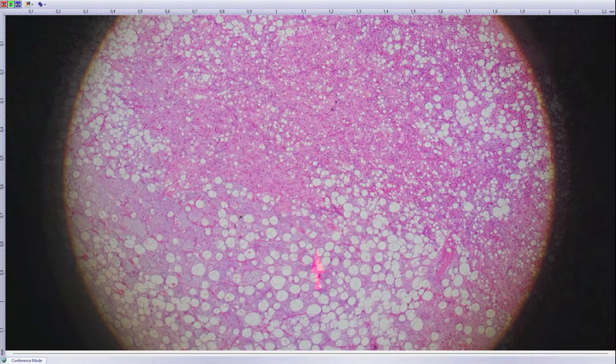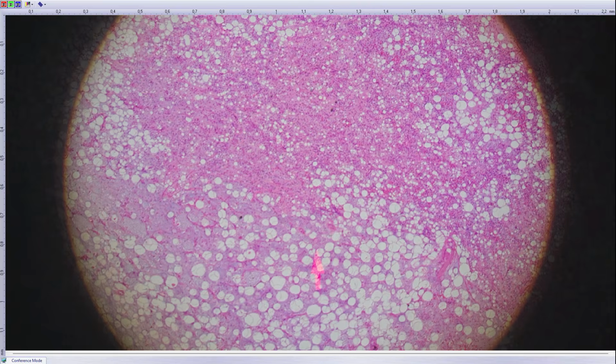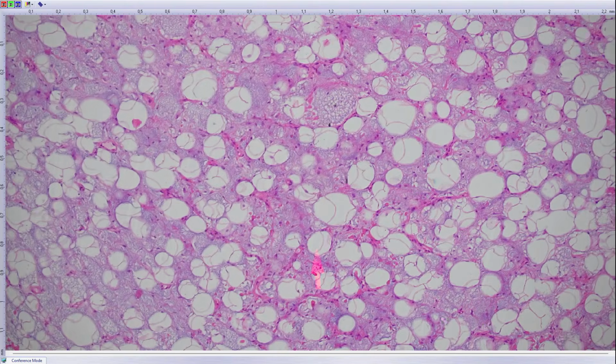I don't recall the location here. But again, typically young adults, tumors on the thigh. Again, here, a beautiful example of the vasculature, typical vasculature for myxoid liposarcoma.